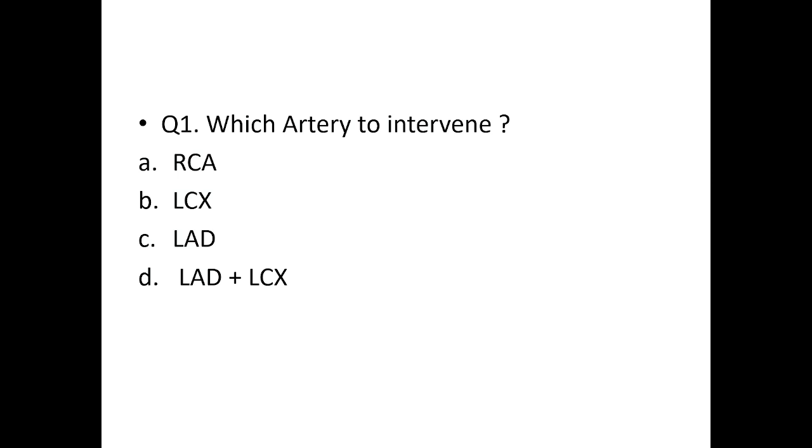Class 3 indication. Now the patient has got angina, sir. Repeated angina. Viability, yes. As there is angina, I considered the patient. So that is not actually a CTO. Yes, sir, the LAD was previously collateralized.